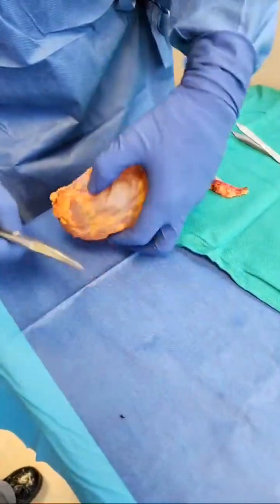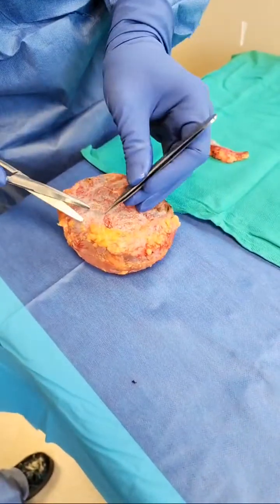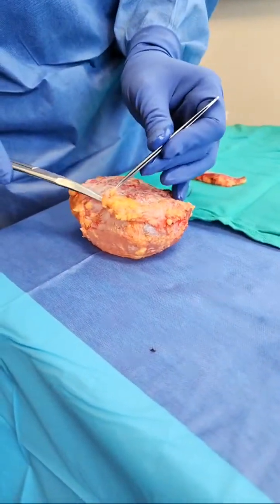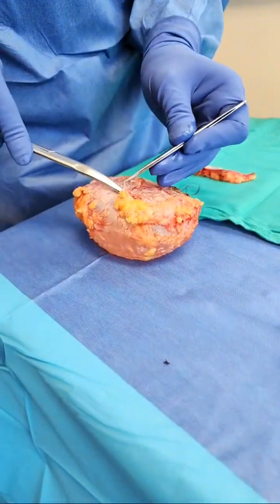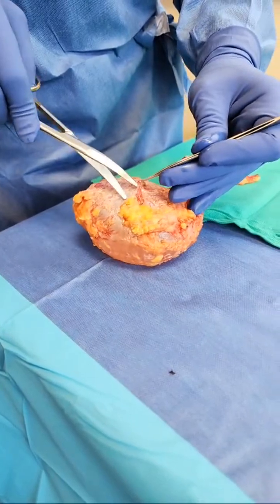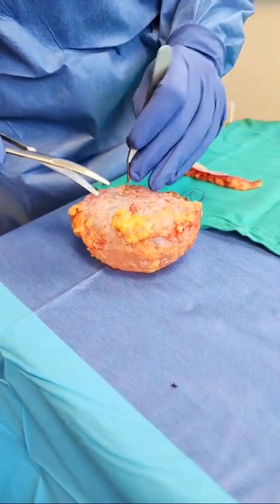So what I'm going to do is flip this around, and I'm going to go ahead and cut this off over here, and let's see what this shows. As you can see, look at these bubbles. This, if you touch, does not look and feel fine. You can see the scar tissue up at the out. So I wanted to incorporate this. So as I go in, let's go ahead and see. Remember, this is very hard, right? This is compressing the implant, and you can imagine if this is sitting against the breast tissue and the nerves of the chest, causing the patient a lot of misery.